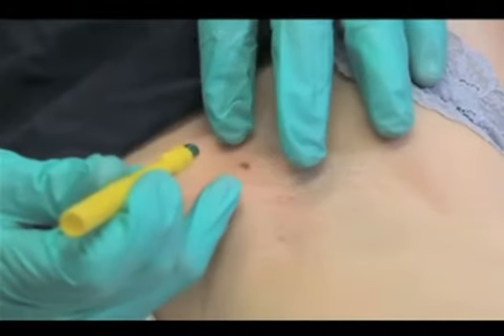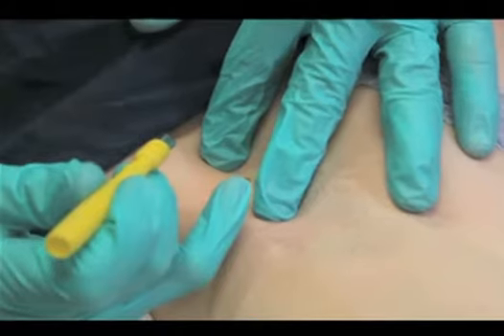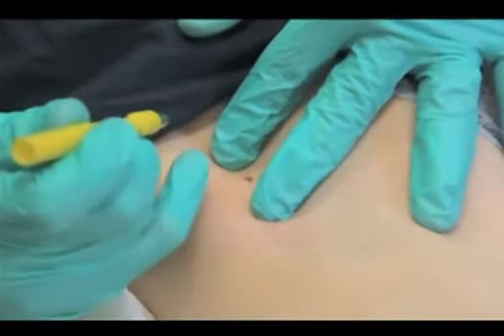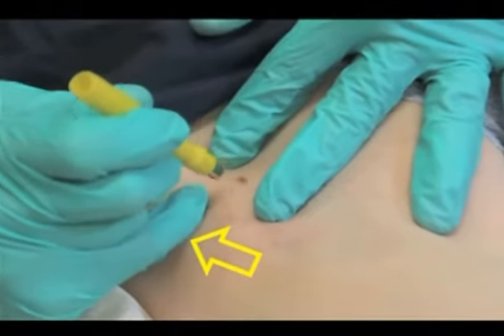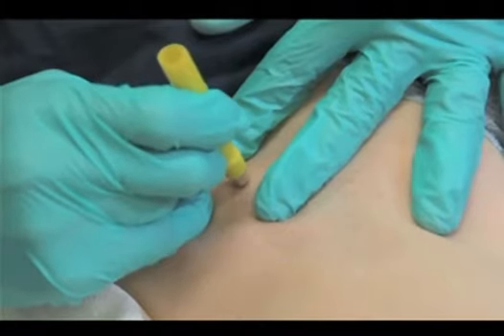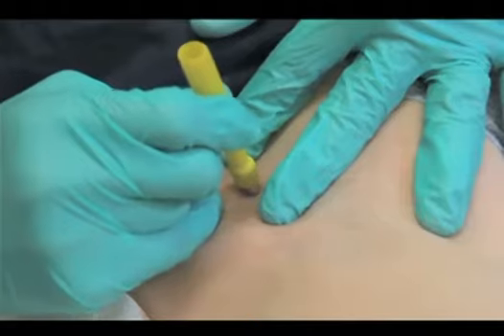Stretch the skin perpendicular to the skin tension lines. This results in an elliptical wound after the punch, which minimizes puckering once sutured. Hold the punch in your hand and place the fifth finger of that hand adjacent to the lesion for stability. Position the punch over the lesion. For pigmented lesions, use your imprint as a guide.